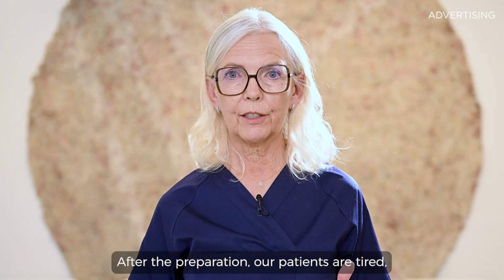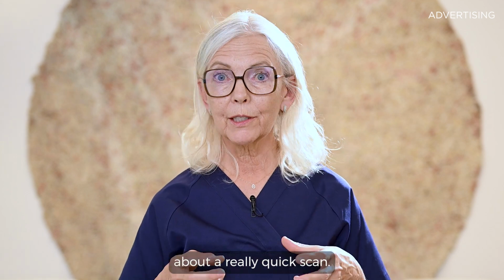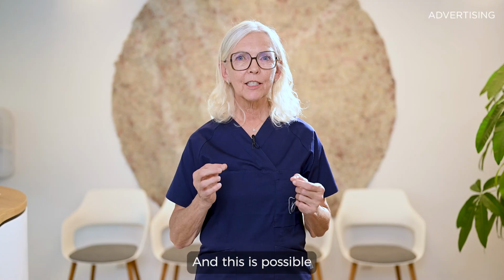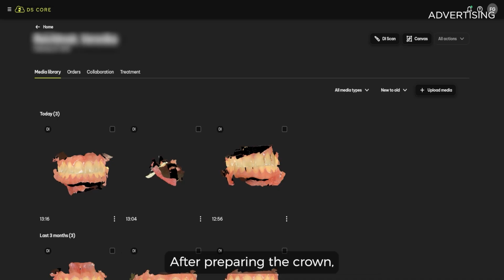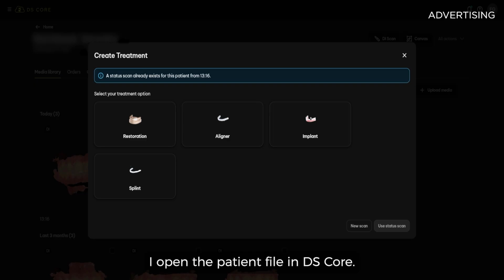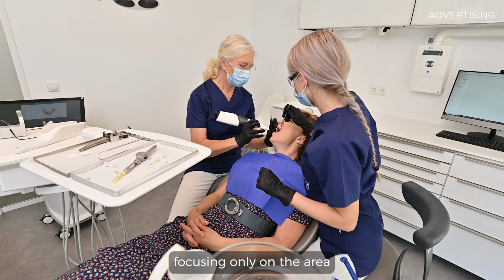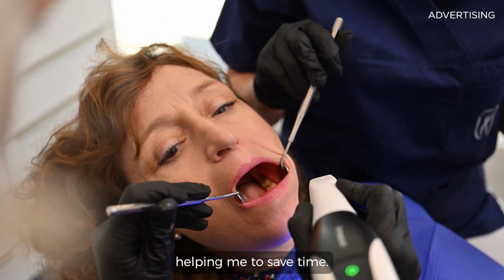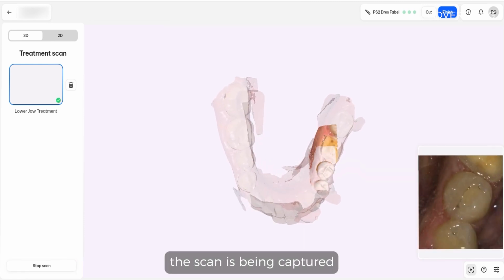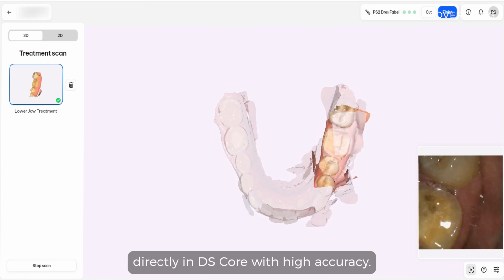After the preparation, our patients are tired, so they are more than happy about a really quick scan. And this is possible because of the very short treatment scan. After preparing the crown, I open the patient file in DS Core. I take the treatment scan, focusing only on the area where the restoration is needed, helping me to save time. As you can see, the scan is being captured directly in DS Core with high accuracy.